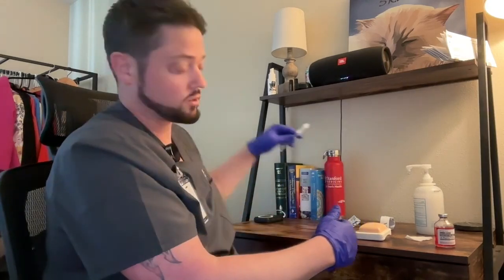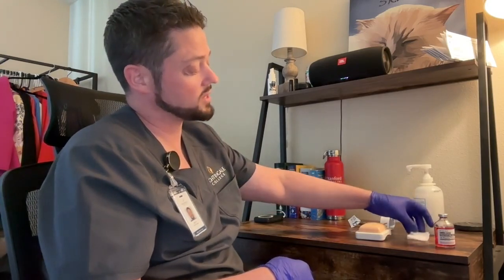We will then remove our needle. We will engage our safety device, and we will dispose of our needle into a sharps container that I have at my side. If there is any blood, we will simply dab that away. We will not massage the area. We will then ask our patient if they have any questions.